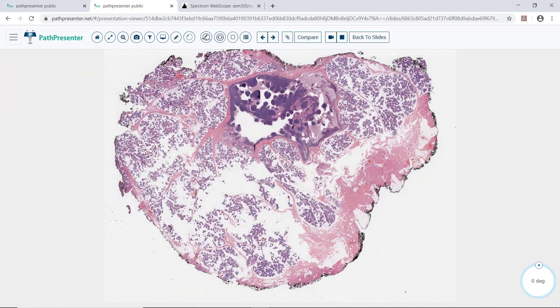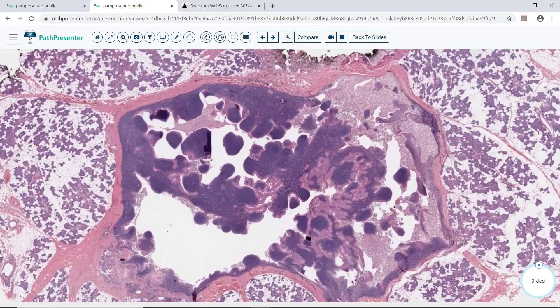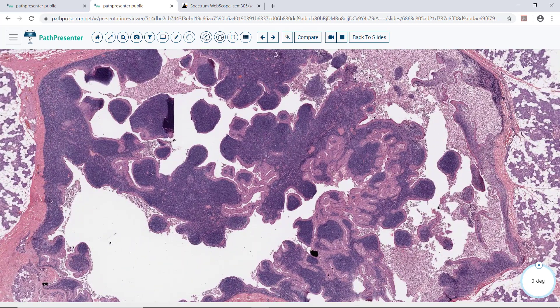Case 5 is Warthin tumor, the same as papillary cystadenoma lymphomatosum. You can see the tumor right here, surrounded by parotid gland with some adipose. At this power, you can see this tumor has a papillary pattern.